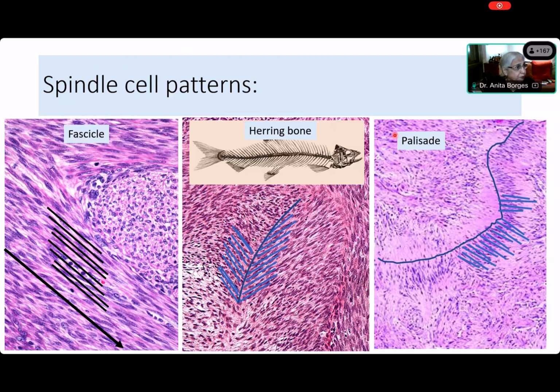So will somebody be able to explain that to me now, Kedar? What did you understand about a palisade? Yes, ma'am. Basically, the word palisade refers to a wooden wall. I mean, it's not a wall. It is a fence. A fence of vertically lined wooden spokes parallel to one another. You have wooden slats, right? Yes, ma'am. Very good. So cells bearing resemblance to this structure can be called palisading, this type of arrangement.